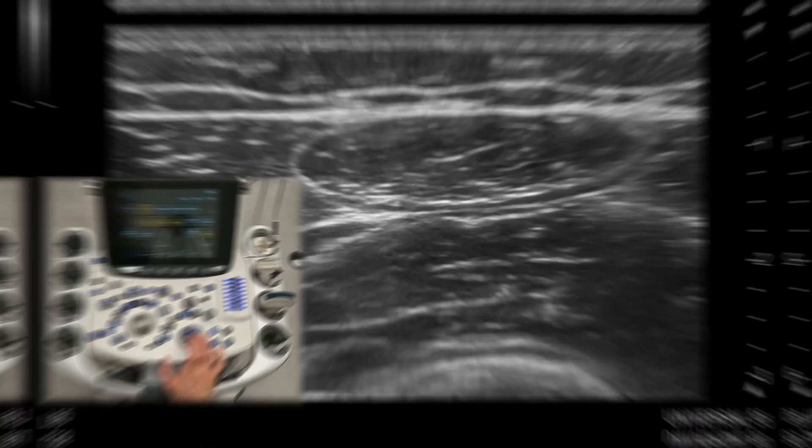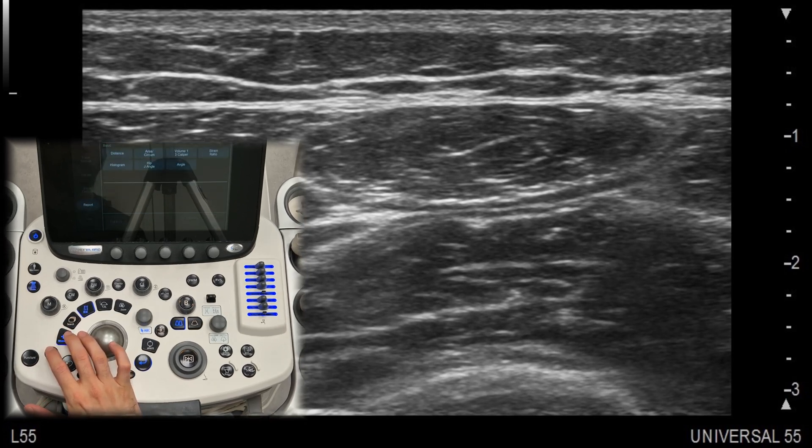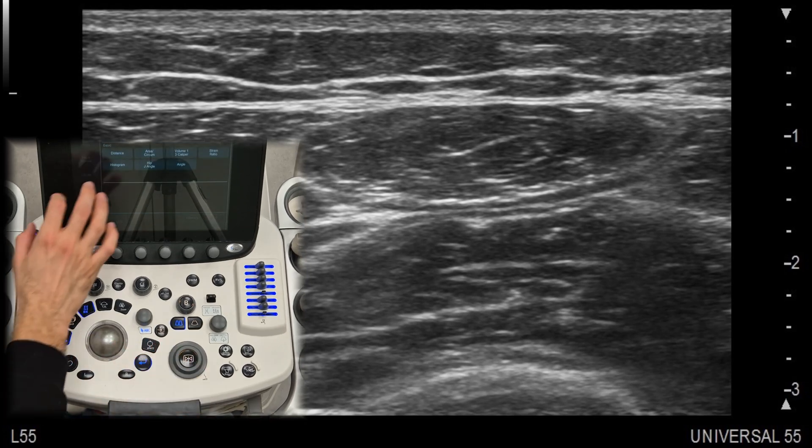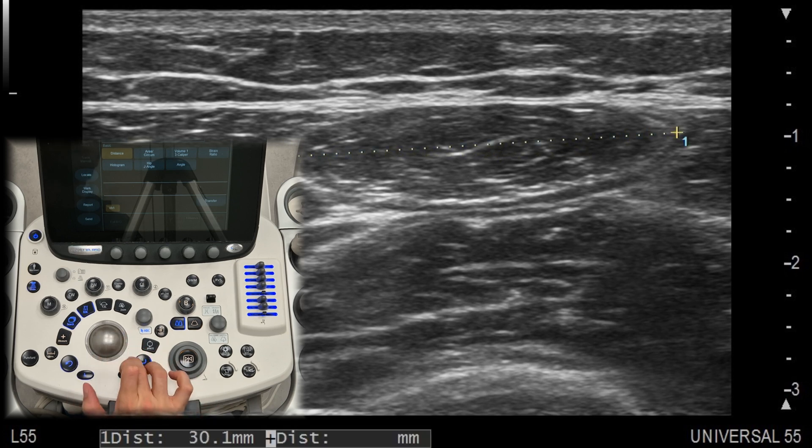Distance. The distance tool allows you to measure the length between two points on the ultrasound image. This is useful for assessing the size of structures like tendons, muscles, or fluid collections. Simply select the starting and ending points and the machine will calculate the distance for you.